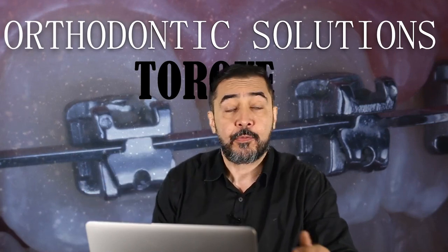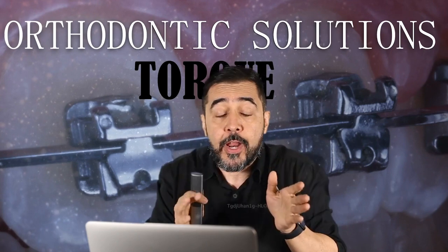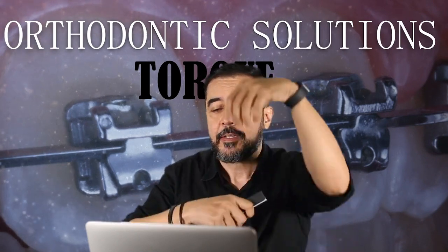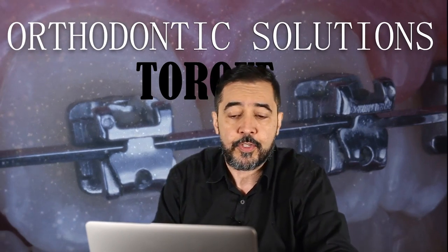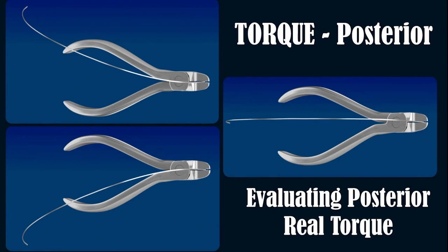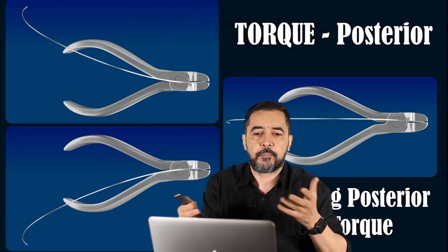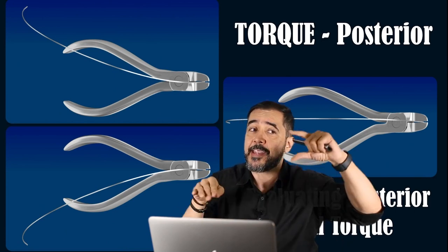Hello, my friends. We're back with the same topic, which is the torsion made directly to the arch wire, to the rectangular arch wire, obviously, because if it is a round arch wire, it won't matter if you do this torsion or not, because it won't make a difference, okay? In this case, we're doing the torsion in the rectangular arch wire in order to achieve some kind of inclination of this segment of the arch wire, to have a relationship between this angulation, this inclination of the arch wire and the inclination of the slot.